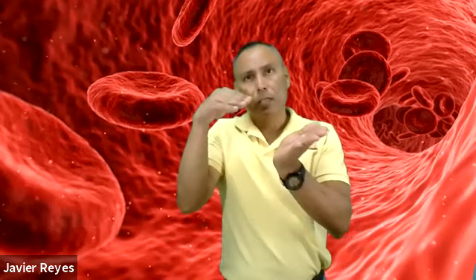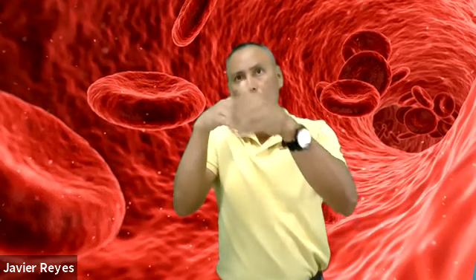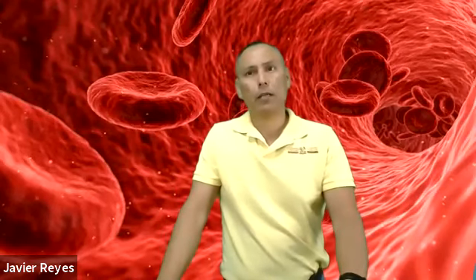If the bevel is only partially in the vein, it causes blood leakage into the tissue, so you start to see a little bit of blood coming under the skin, and that's what could happen, right? Because you partially penetrated the vein, it's partially in, so the blood will seep out into the tissue, and you see bruising starting to form, or a hematoma.